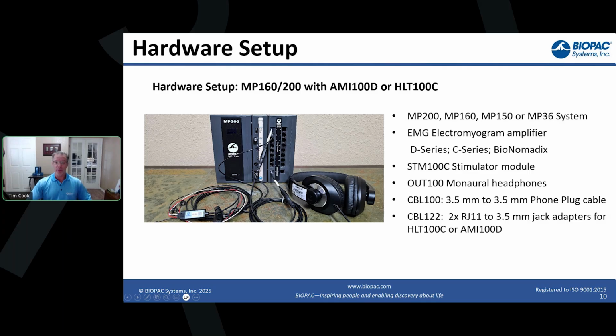We're then going to be using our stimulator, which is our Stim 100C, pictured as this central unit right here. We've got our headphones, and then again, as pictured here, that is the fEMG amplifier. And I think you might be able to see it here as well. So that right there is the actual amplifier. Beautifully small, super lightweight, really lightweight leads. You can just route them behind the ear, and honestly, the subject hardly even knows they have them on.